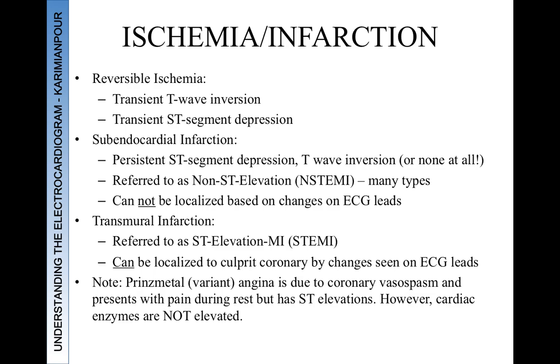That could mean that they're either depressed and there are T wave inversions, or there are no ST changes at all.